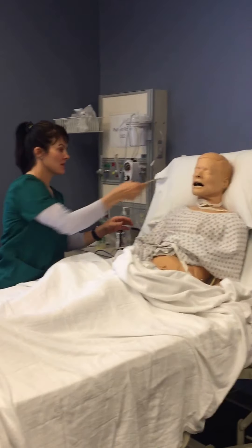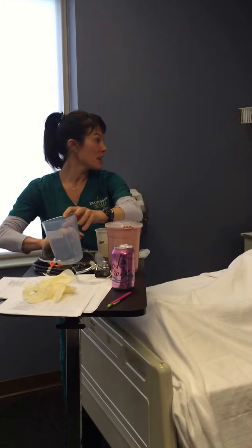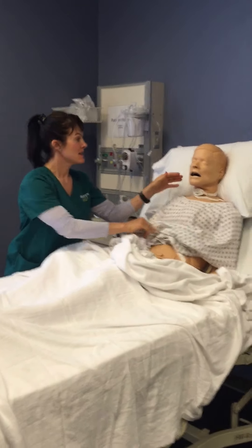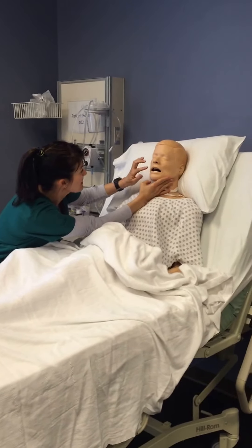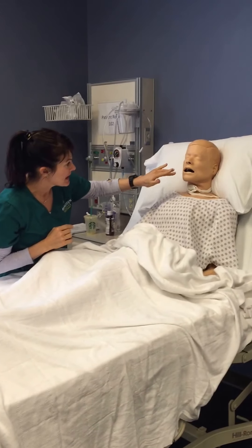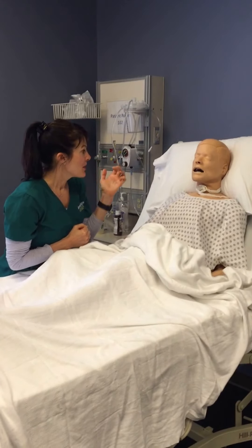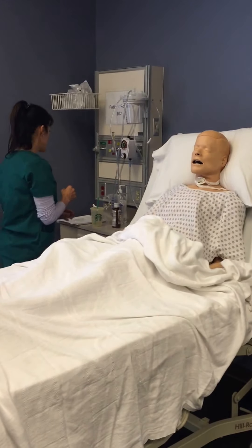What we're going to do is we're going to insert a nasal gastric tube today. So I'm going to raise the bed and put it in High Fowler's. As I'm doing that, I'm assessing his mental status and also checking his nares, making sure they're intact and that he doesn't have a deviated septum. I'm going to ask him to occlude each side and see which one he can breathe better out of. We decided we're going to go to the right side. So I'm going to use hand hygiene.